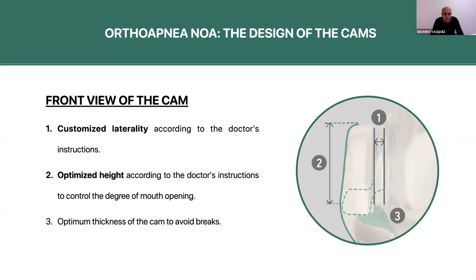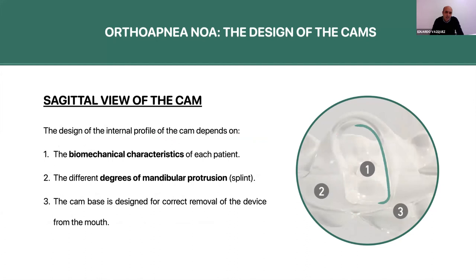If we see the cam from a sagittal view, you will see that this curve, the inside profile of the cam, is going to change according to the mandibular kinematics of the patient. So this profile is not going to be the same for all patients. It's going to change depending on the individual kinematics of the patient. Also, the height of this cam is going to change according to the needs of the patient.